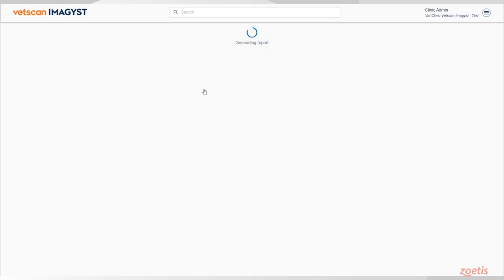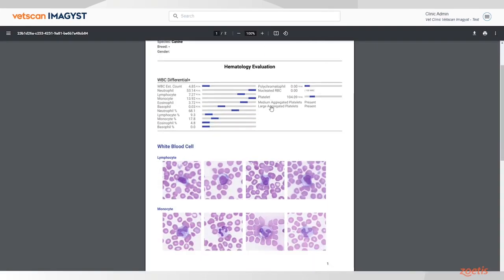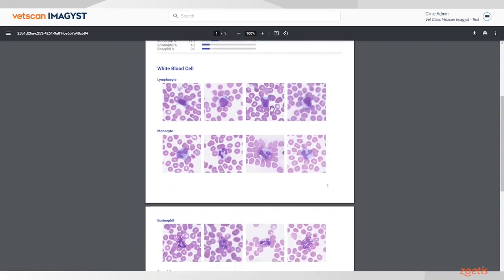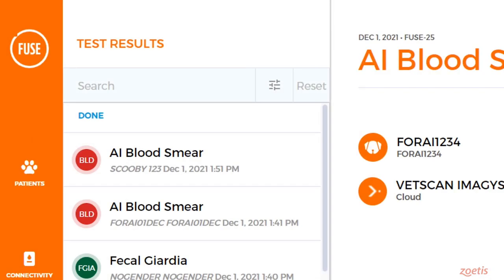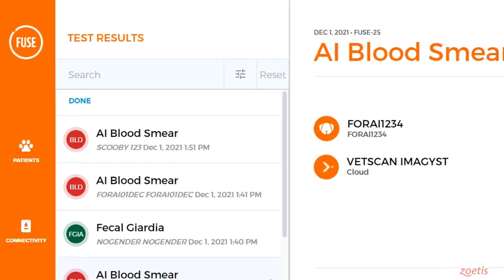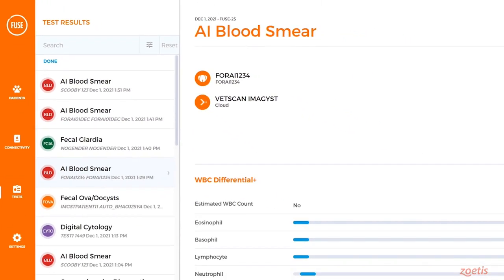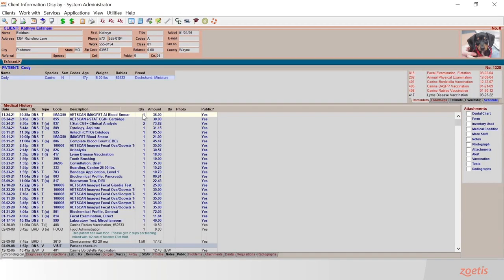Anyone can review the report from within VetScan Imagist with a shareable PDF report. Once the results have been transferred over, the report can be accessed within VetScan Fuse along with other diagnostic results. And finally, the report is sent to your Practice Information Management System for patient ID 1328. This completes the test order.